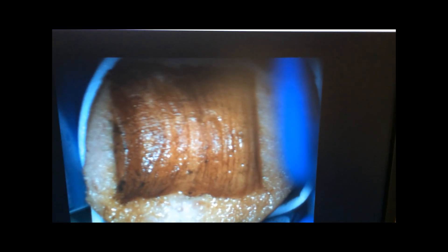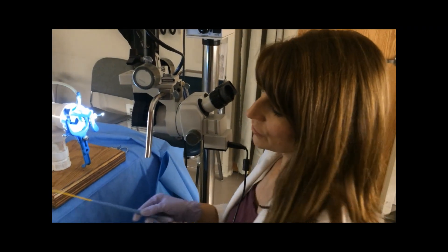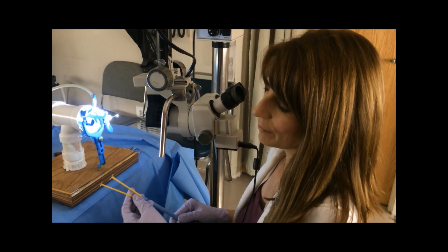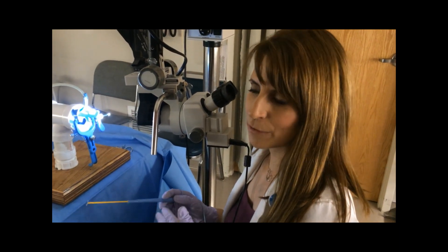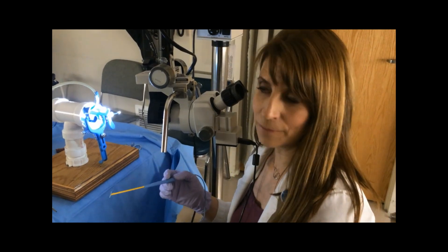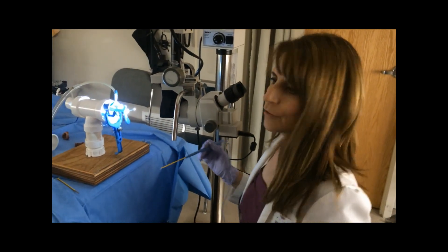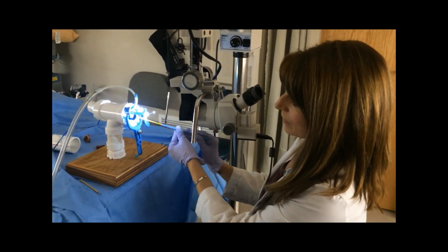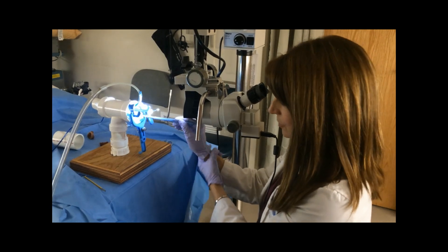I am going to turn down my setting. Depending on the size of the loop that you use, if it's a smaller wire then you're going to use a lower amount of electricity. For the first one I used a setting of 46 on cut, and this one I'm going to do 36 on cut. You can do what's called a blend, and that's very common to do. I find with my machine that the cut alone works very well. Remember that your machines do vary — my old machine needed to be set in the 70s, so there is dramatic variation.